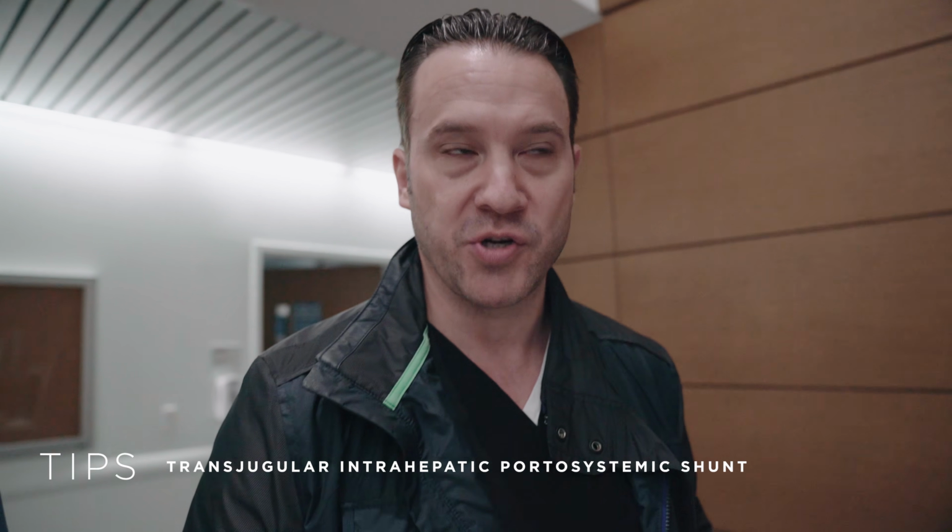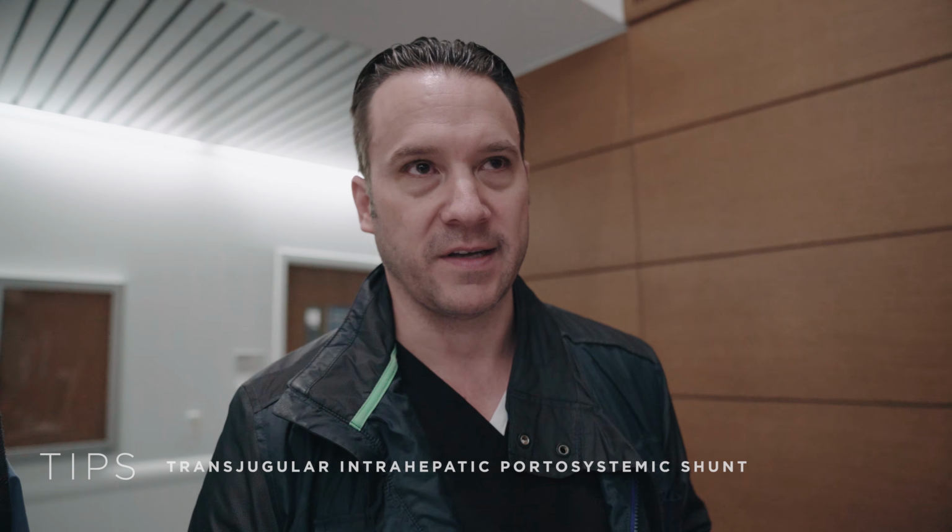So we're at the Gates Vascular Institute today. We have a very interesting case. We're doing a transjugular intrahepatic portosystemic shunt, which is a shunt in the liver for patients with chronic liver disease. We're excited to be here today. We're using the AccuNav ICE IVUS probe, and we're very lucky to have our reps here with us.